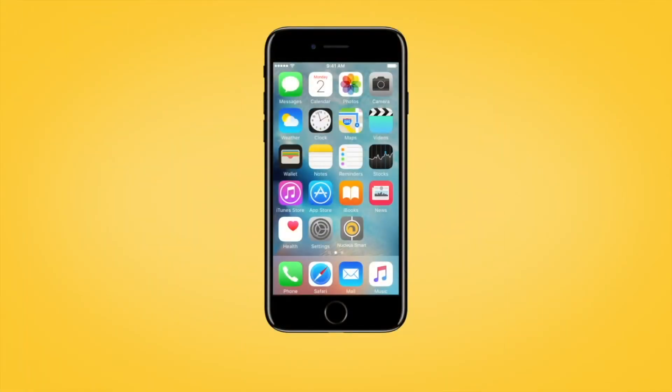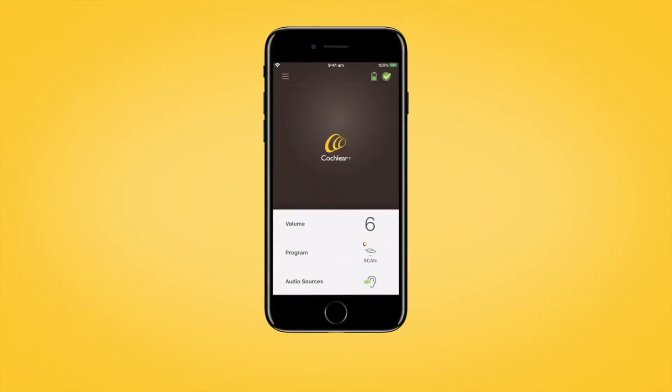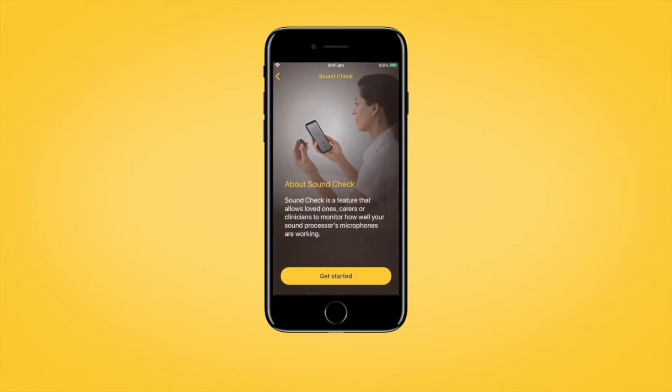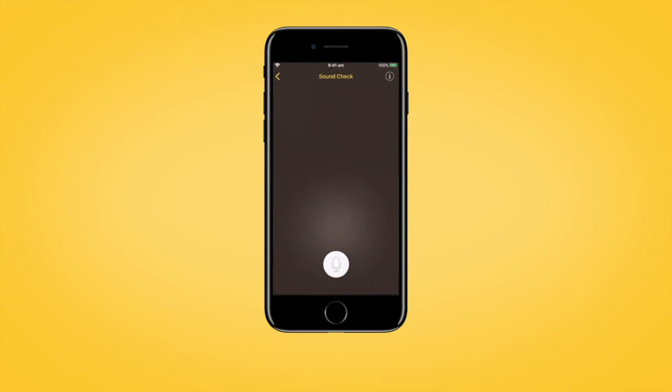To use Sound Check, open the Nucleus Smart App and tap the Processor Status icon in the top right-hand corner of the screen to open the Status screen. Then tap the Sound Check icon in the top right-hand corner of the Status screen to open Sound Check.